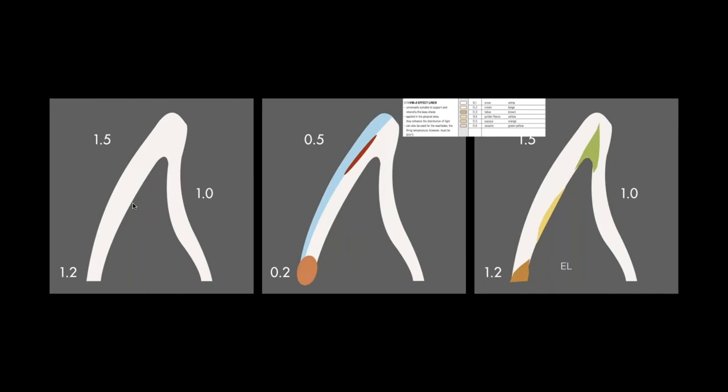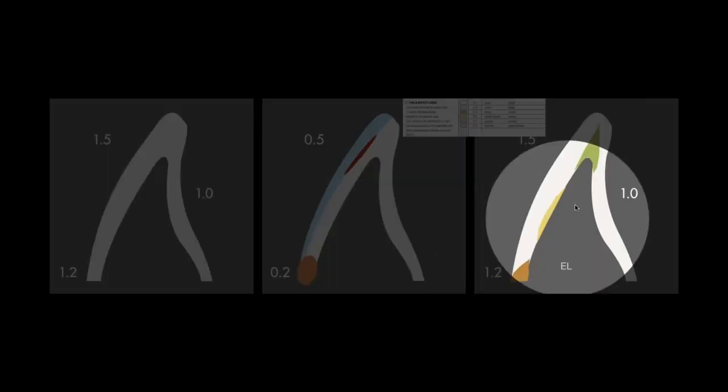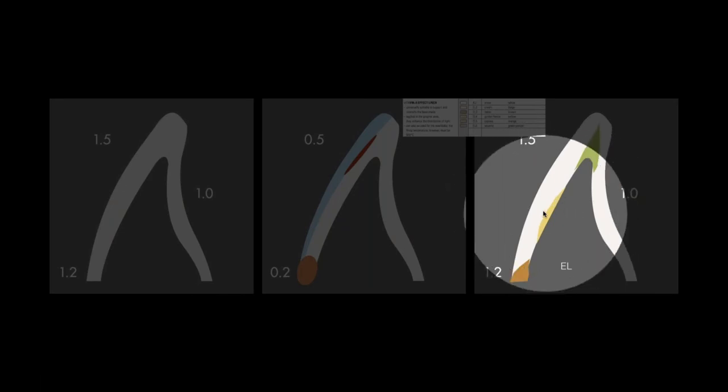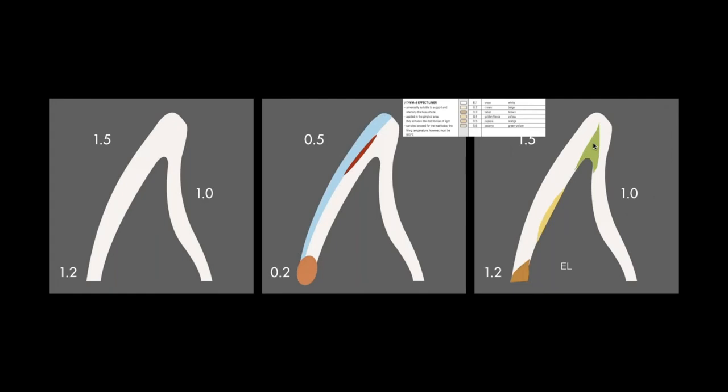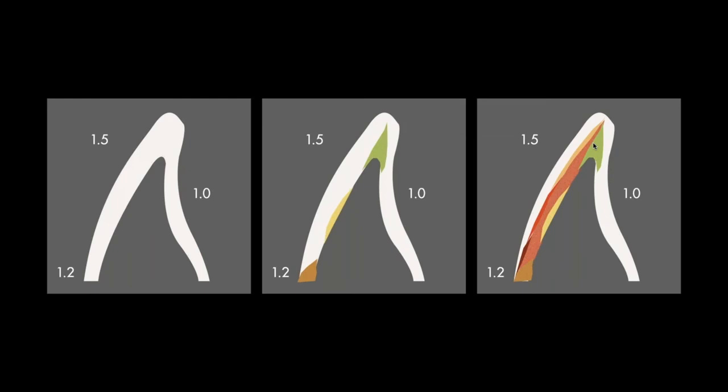So I would spend some of that time understanding where I wanted to create my chroma, which is always more in that cervical area that you see down here, where I wanted my value, which is always in that middle third, and where I wanted to get more of a translucent or age-related type tooth. And those become the kind of keys that I look for. Now, I can make those way more complicated by using 3 or 4 or 5 more powders, but I can also make those less complicated by using my zirconia substructures to add into that process. So that designing part is critical.